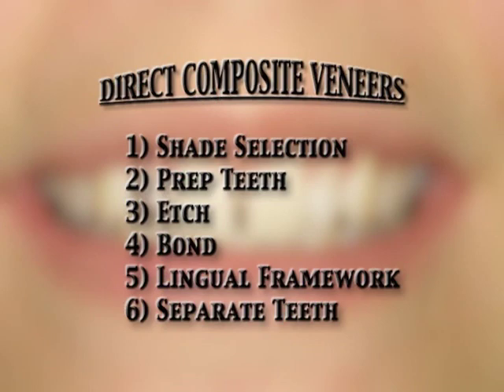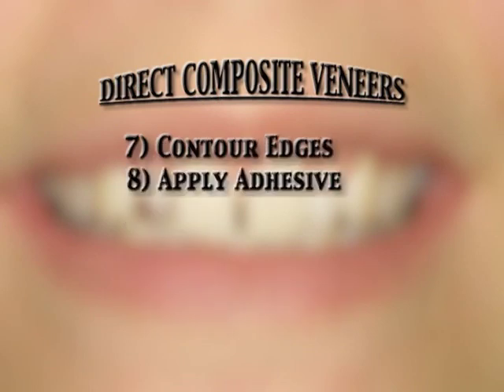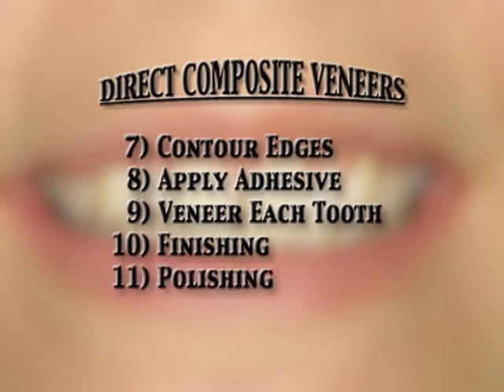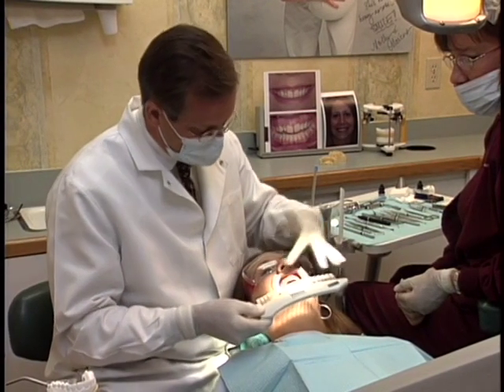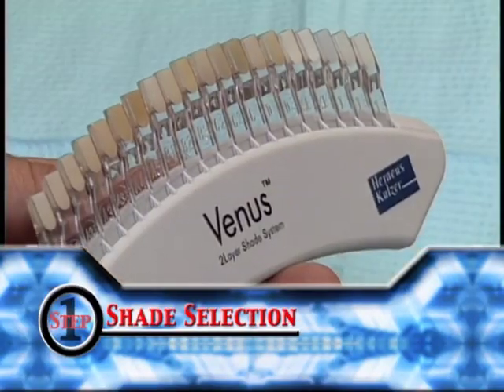Step 6. Separate the teeth. Step 7. Contour the edges. Step 8. Apply new adhesive. Step 9. Veneer each tooth. Step 10. Finish. And finally, Step 11. Polish. Begin by determining the proper shades of the Venus composite using the unique Venus 2-layer shade guide.